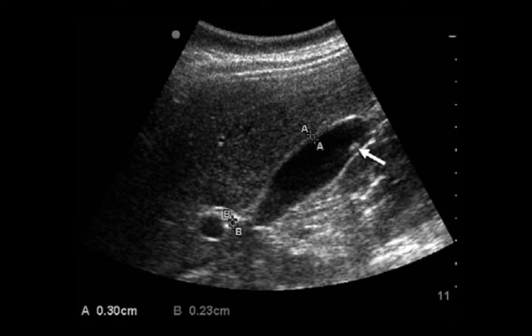An abnormally thick wall suggests inflammation and is often present in acute cholecystitis. However, it is a nonspecific finding, and many other pathologies, as well as a postprandial gallbladder, can give you a falsely elevated measurement. The differential for a thickened gallbladder wall includes renal failure, ascites, hepatitis, multiple myeloma, cholecystitis, and even heart failure.